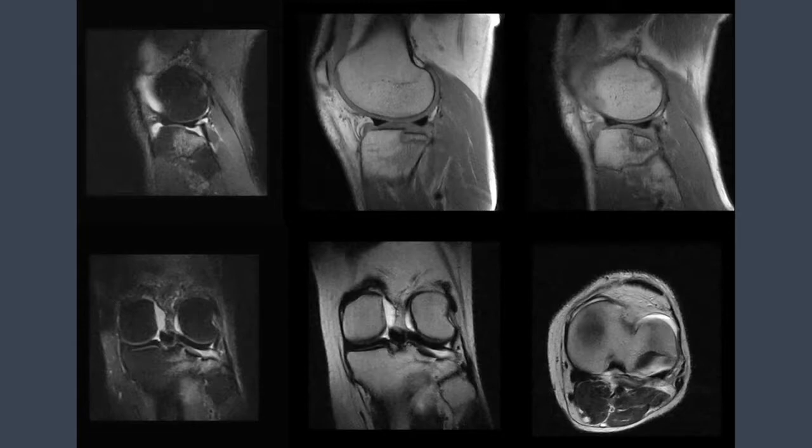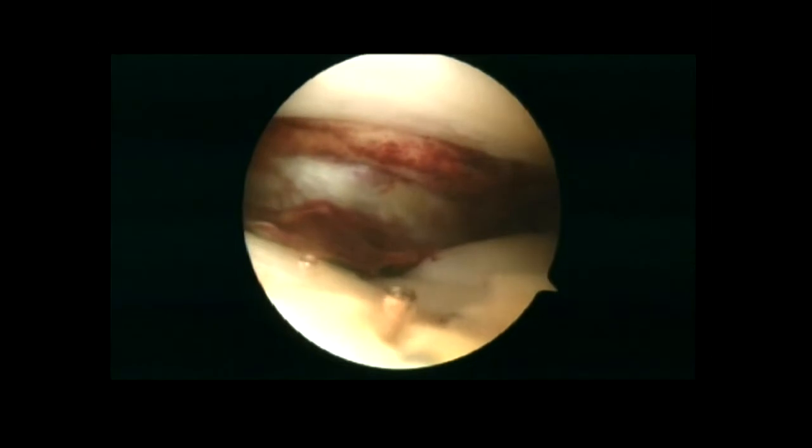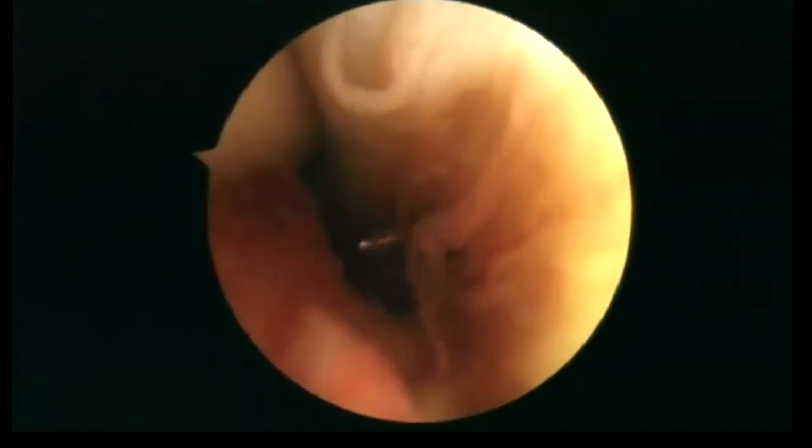When the diagnosis of type 3 tibial plateau fracture is made based on the imaging evaluation and confirmed during arthroscopy, additional working portals should be created to achieve proper access to the posterolateral tibial plateau fracture. At first, the mid-lateral portal is created 1 cm anterior to the popliteus tendon.